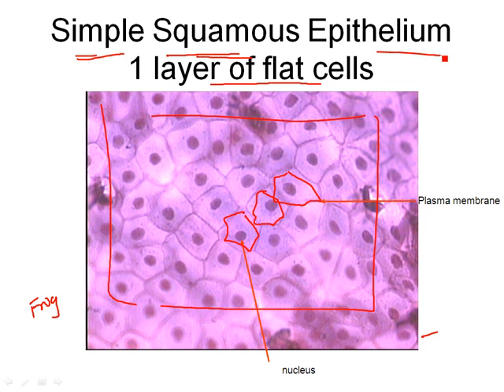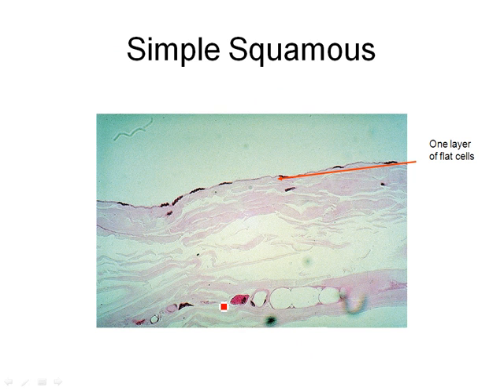There's some other things you can also identify. On these cells, the stuff that divides the cells, that's the plasma membrane. So that's the membrane that's surrounding the cell. You can actually see that between these cells. And the dark spots in the middle, that's the nucleus. So on this slide, I may say, what are the dark spots in the middle? And you would say that's the nucleus. So make sure anything that I've got labeled on this PowerPoint is fair game. Okay, so I'm just telling you right now, this PowerPoint is fair game for anything you need to know about lab.